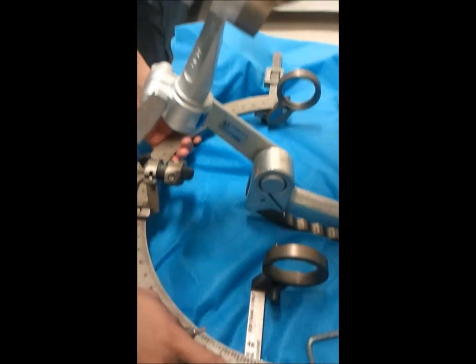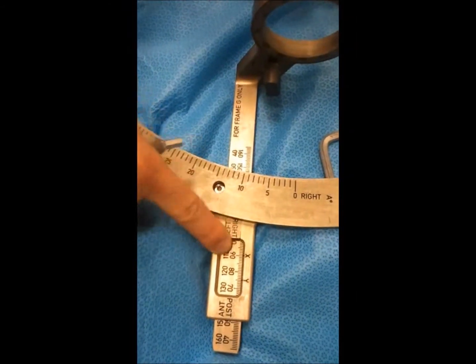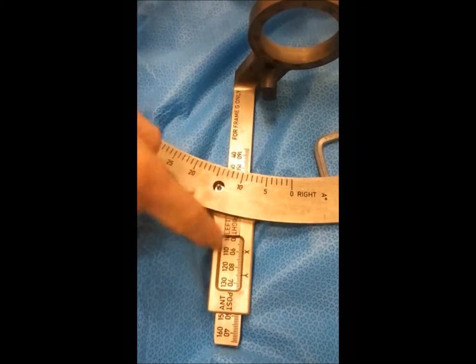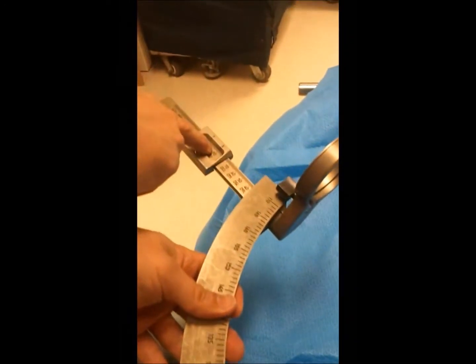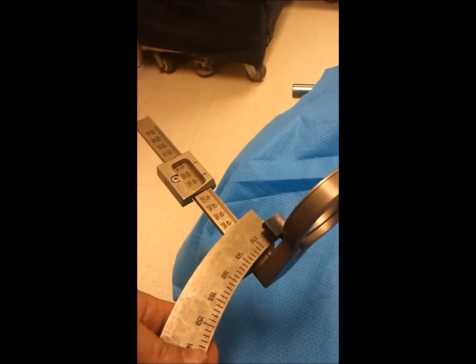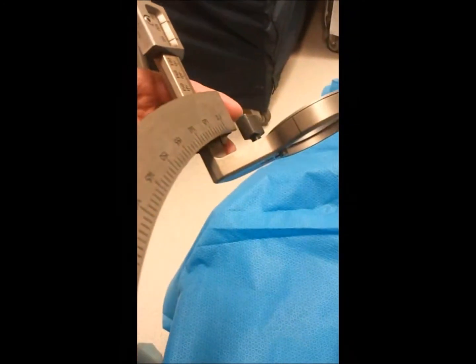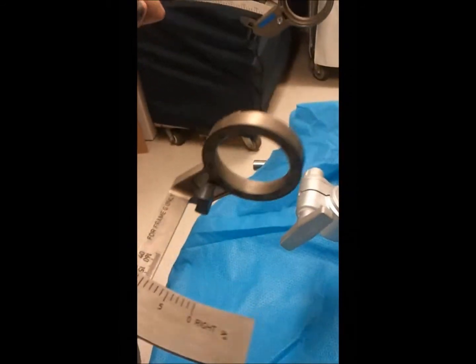Our lateral coordinate has already been determined beforehand by locking these components. This screw here controls that one, and then our left side is going to be controlled by this metal piece and locking that in. And then again, remembering that this device here with this screw on the back can be slid in and out, and it'll want to be slid out.